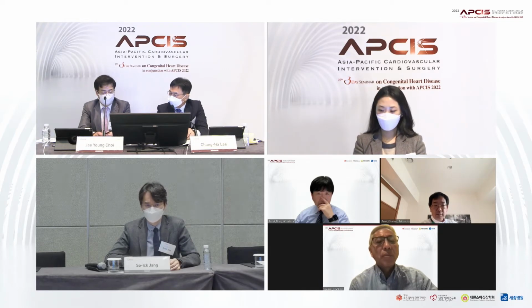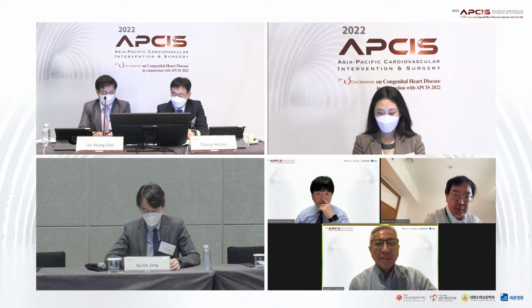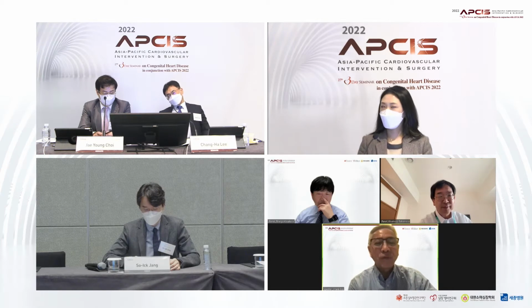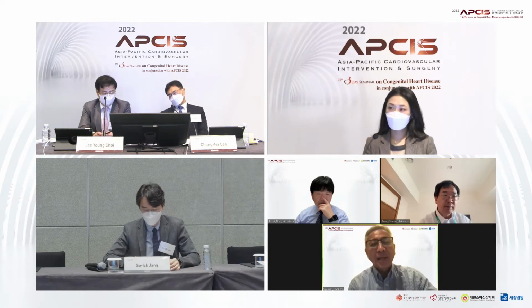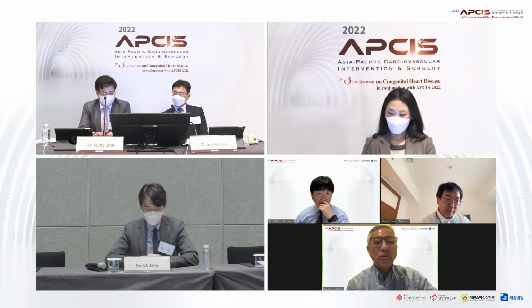What do you think? Yeah, so if there was a bigger stent in there that I know can get to adult size, I would try to talk my surgeon into leaving it alone. Like I said, there's been plenty of times where the surgeon took it out or did different things, and then I'm back in the cath lab within 6 months, and I have to put another stent in to fix the stenosis. Can we unzip using the ultra high pressure balloon? Well, yes, you can theoretically, but it's kind of unpredictable.